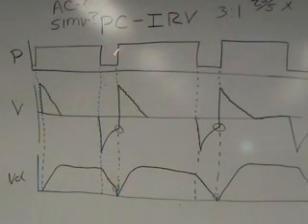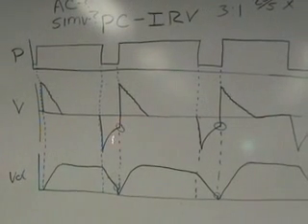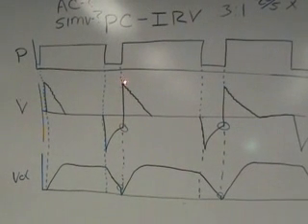But since I have such a short expiratory time, the next inspiration begins before the gas and the volume have come all the way out. I essentially trap that gas there. I mean to do that. And my next breath begins the cycle over again.